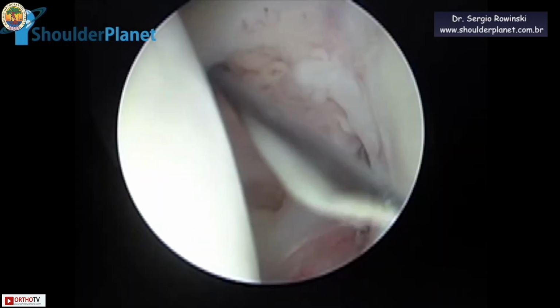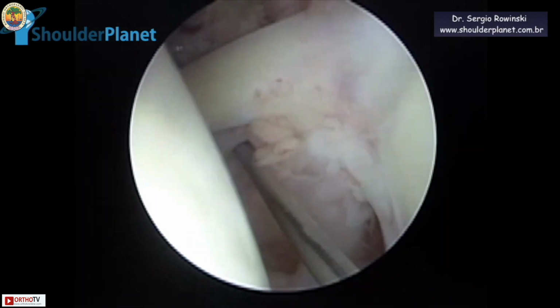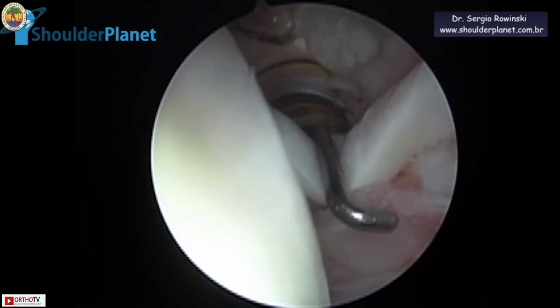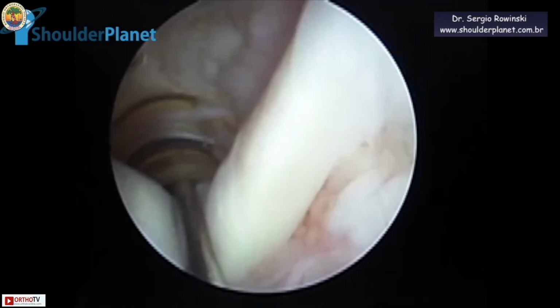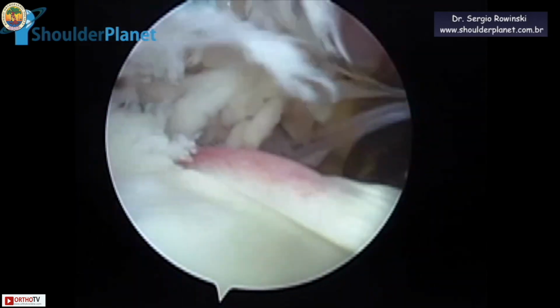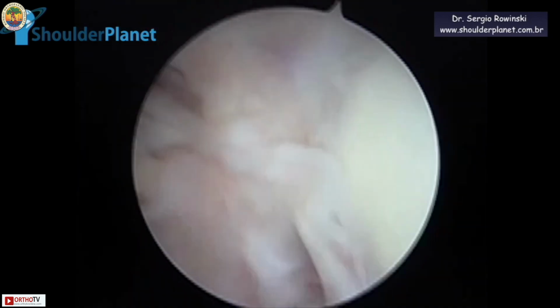This is a left shoulder. We establish an anterior portal with a spinal needle. Once we established the anterior portal, we first evaluated the biceps, pulling it out of the pulley, and it had a lot of synovitis, so we decided to perform a tenotomy.